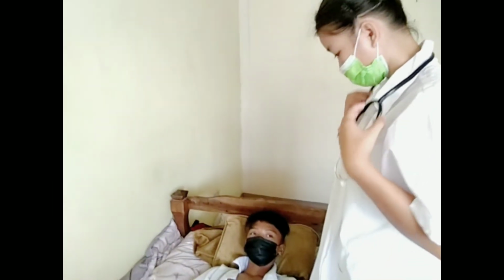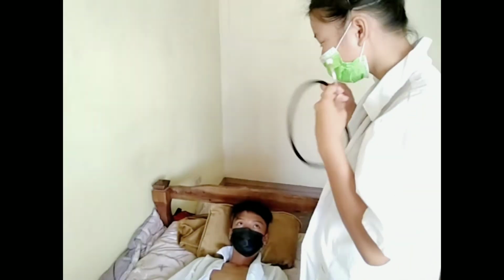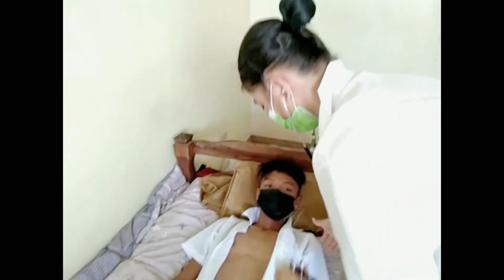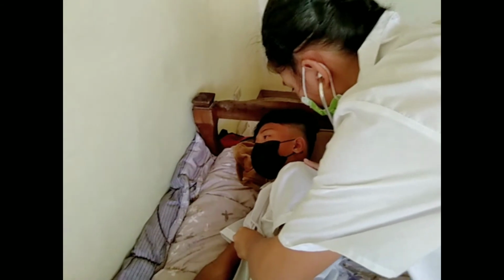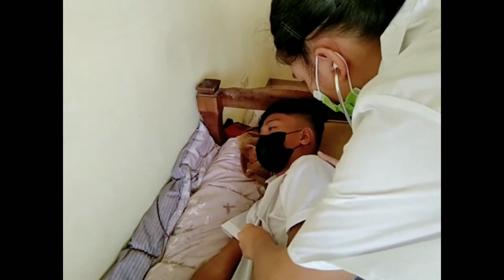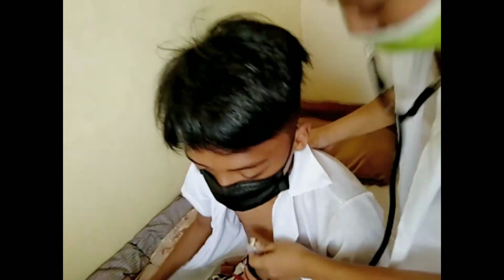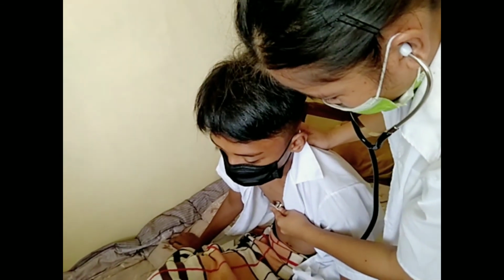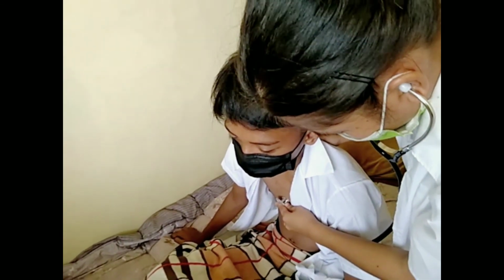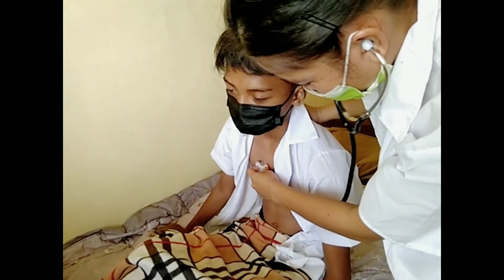So sir, I'm going to assess your heart rate and rhythm. Can you please inhale and exhale?